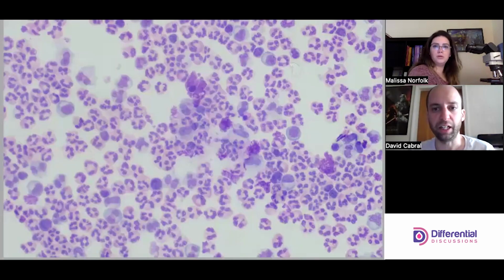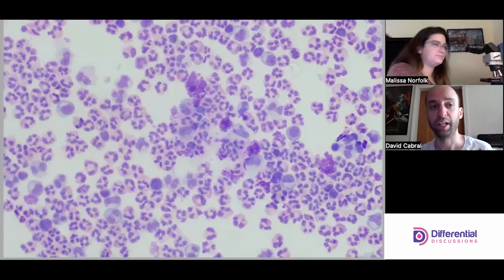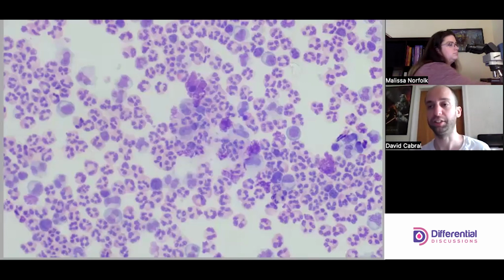So we see a lot of cells here, and it looks like a pretty good mix. One of the biggest challenges is that the number of cells is a lot. I think it's a skill in and of itself, a skill that overlaps with retics.